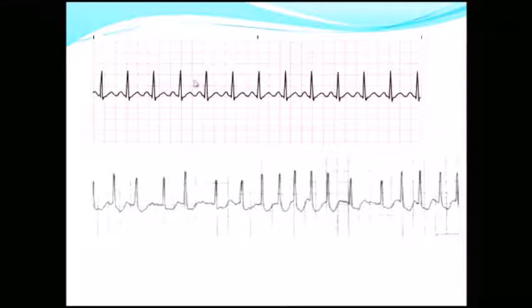I wouldn't be exact, like, oh, 300 divided by 2.1 is about 153 or whatever. Just say 150, okay? So, for those who weren't following, it's 300 divided by the number of big squares between two R waves. So I would probably choose this one because it lands on the thick line. So it's really easy to see this is 1, this is 2. Okay, so 300 divided by 2 is about 150, okay? You could choose this one, choose this one. Yeah, choose ones that land on the bold line, okay? And Sean, for an irregular rhythm.